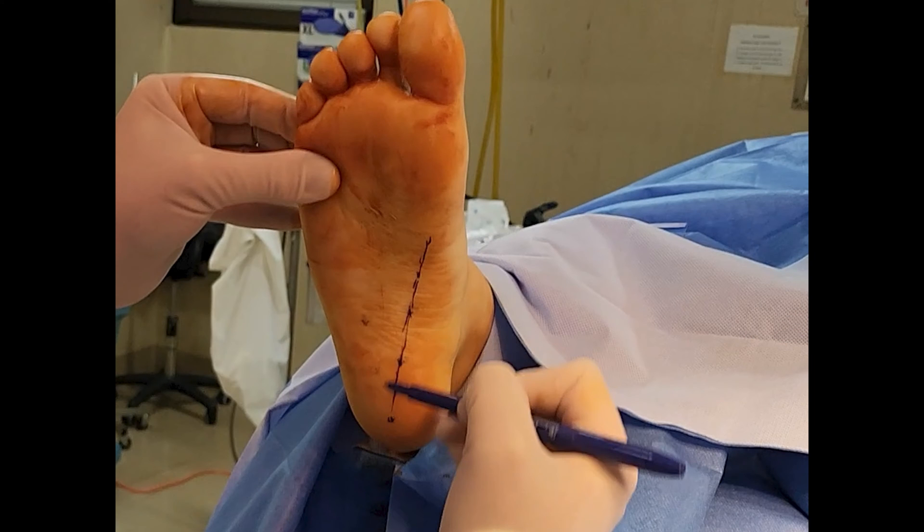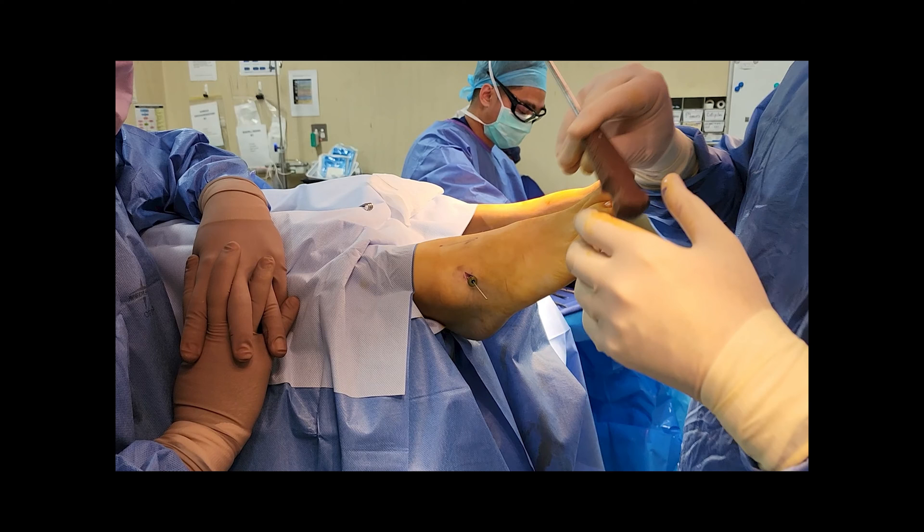Hey all, this video is going to look at how much a subtalar joint arthroresis changed the subtalar joint axis location, as described by Dr. Kevin Kirby.